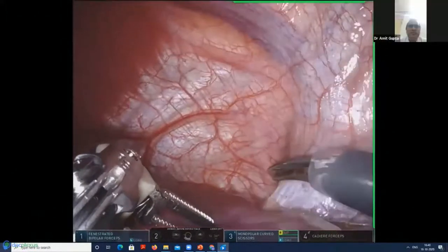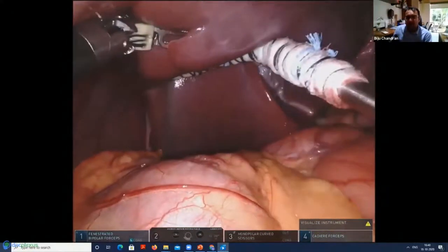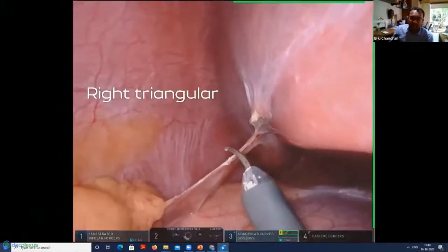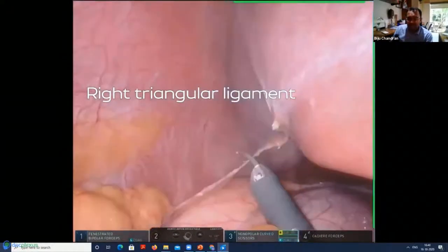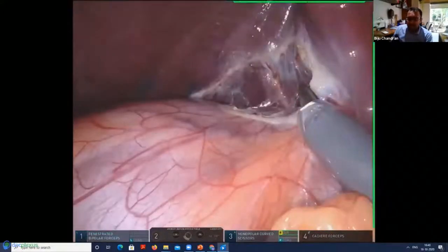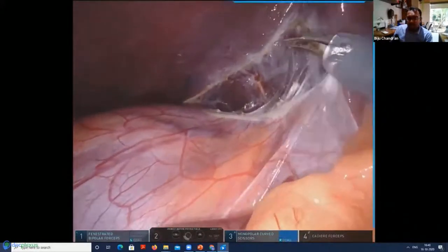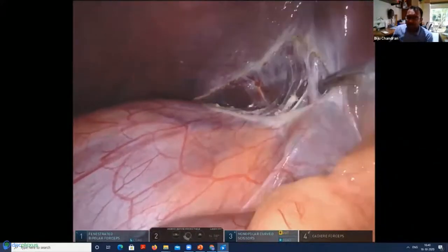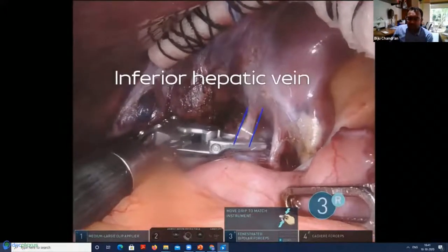The fourth arm is used to retract the gallbladder, and a gall finger gives traction on the liver. We pull the kidney down and divide the right triangular ligament, then proceed to divide the bare area. The IVC along with the caudate process of the caudate lobe comes into view. You may encounter inferior hepatic veins — assess if they're reconstructable. This one is very small, so we'll clip and divide it rather than reconstruct it on the bench.